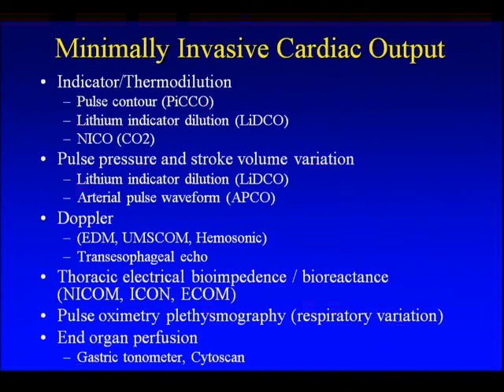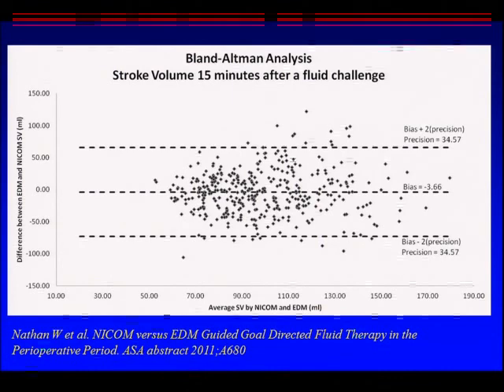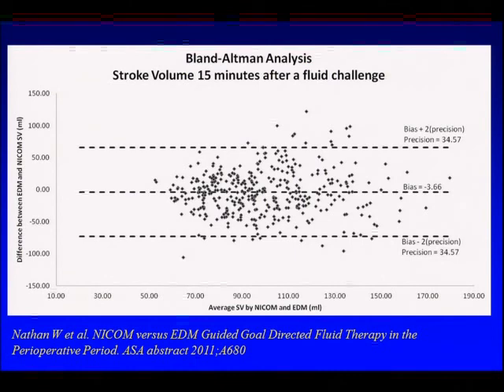Now, there are many monitors on the market that one could consider using for goal-directed therapy. In our hospital, we use a number of different ones. The next study I'm going to show you is a study that we just completed, essentially comparing the NICOM device, which is totally non-invasive, versus an esophageal Doppler. As I showed you earlier, most of the evidence on goal-directed therapy has been done with the esophageal Doppler.